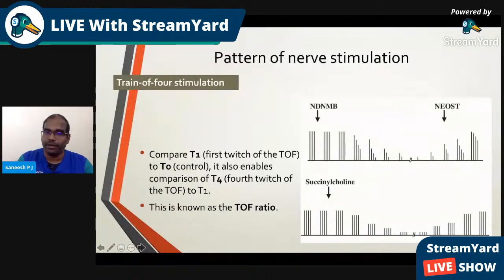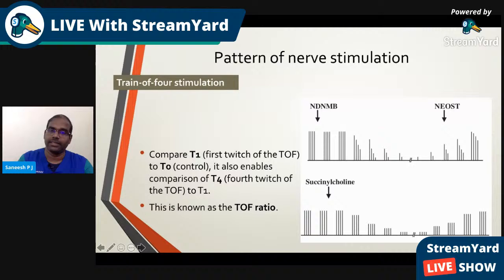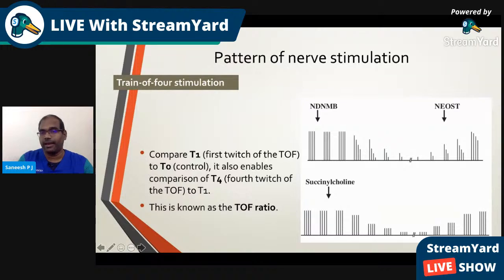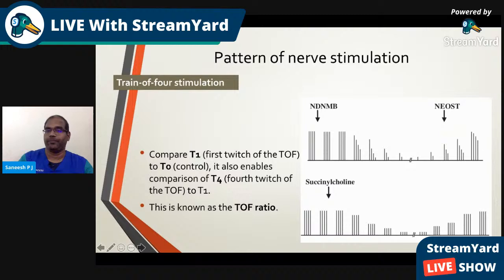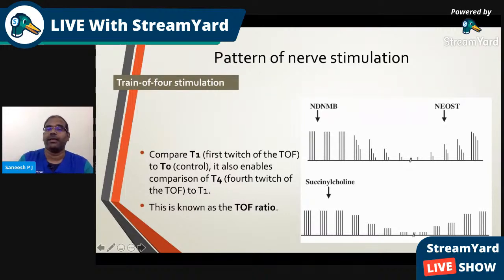You can see the phenomenon of fade: after a few responses, the fourth response gradually diminishes, then the third, then the second with respect to the first — progressive fade. In deep block, the fourth disappears, then the third, and even the second or first can disappear. Once you give neostigmine, the twitches return in recovery — first the first twitch, then the second, then the third, then the fourth. Adequacy of response is assessed by the TOF ratio: the amplitude of the fourth response with respect to the first.